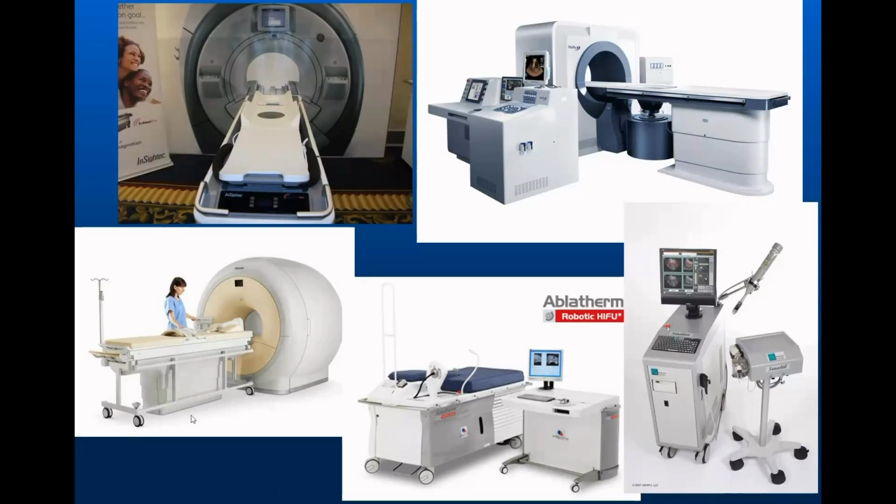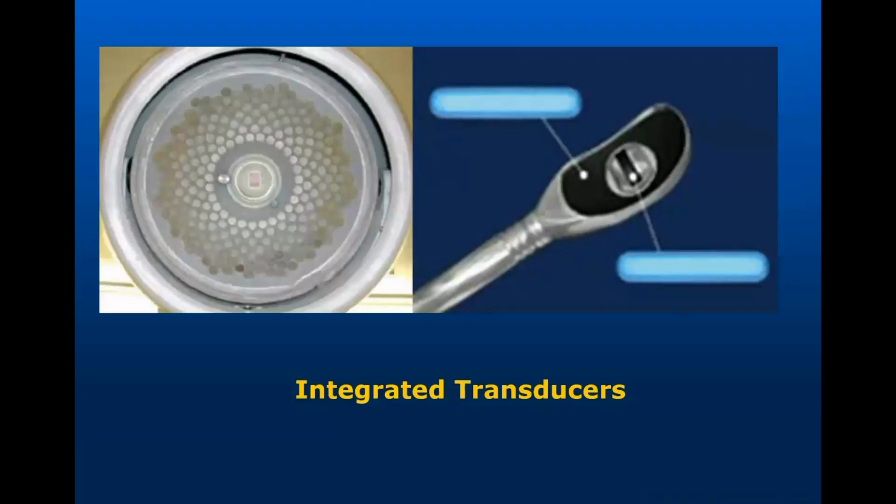Okay. So the way these machines work is basically, this is where the magic happens. The transducer actually has two components. You have the therapeutic component here, and you have the imaging component here. So when you are doing the treatment, you can treat with this and see what you are doing with this. And if this is an ultrasound guided machine, you will see the echogenic cloud that we talked about before. This is how you know you are doing the ablation.